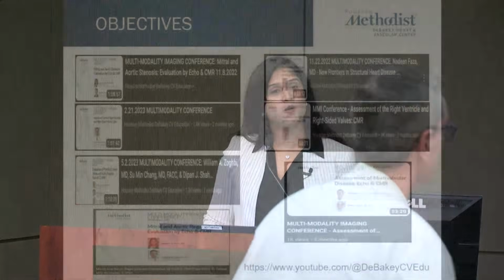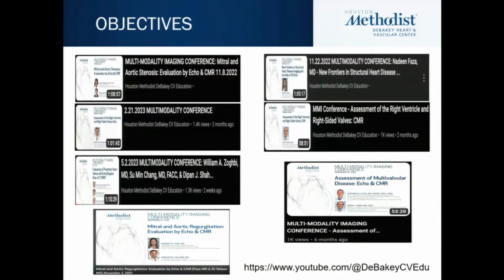Thank you for the kind introduction, Dr. Little. We have no disclosures. Throughout the year, our faculty have done an exceptional job in teaching us the multimodality approach to isolated and mixed valve disease. For the next hour, we would like to apply this learning to a complex valvular case and what we would do in a real-world scenario.